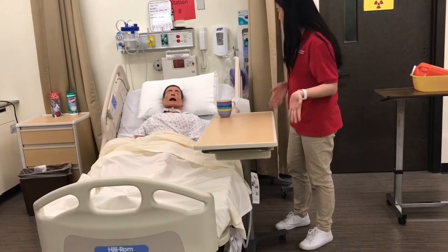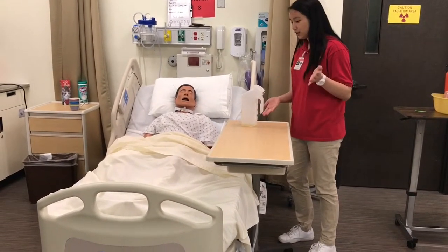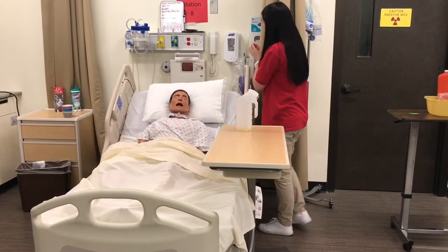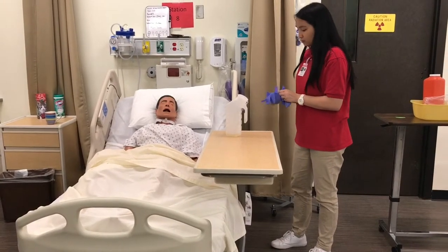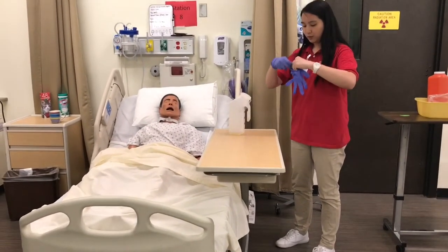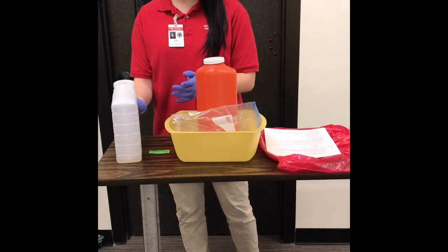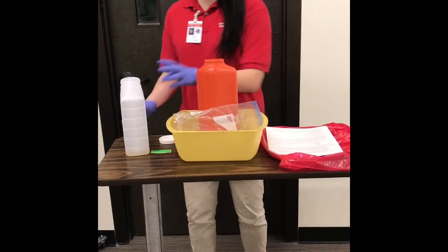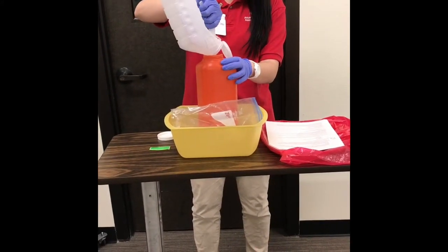Here's a cup of water today to help with the process. I saw you press your call light and that you finished urinating. I can see there's no feces or any contaminants in there. I'm going to do hand hygiene and put on some clean gloves. Now I'm going to be taking this urine to the 24-hour urine jug. Here in the bathroom, I'm going to dispose of the urine into the 24-hour urine jug that's kept in ice. We'll make sure to do this within a 24-hour period — every time the patient presses the call light, I'll get the urine and pour it into this jug.